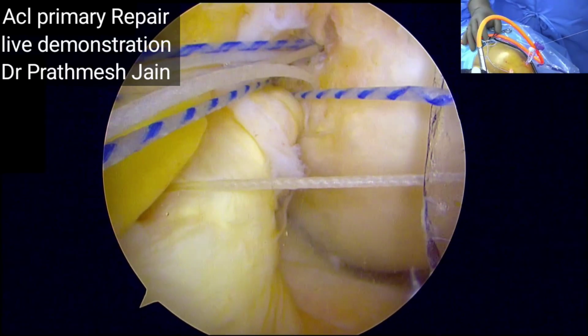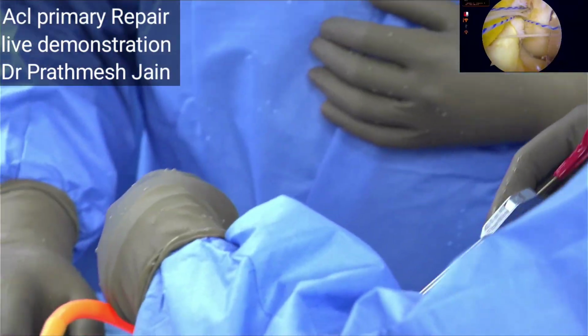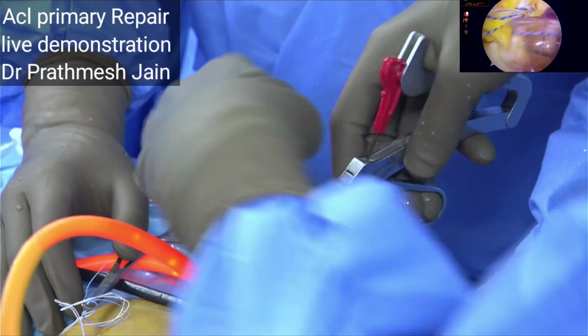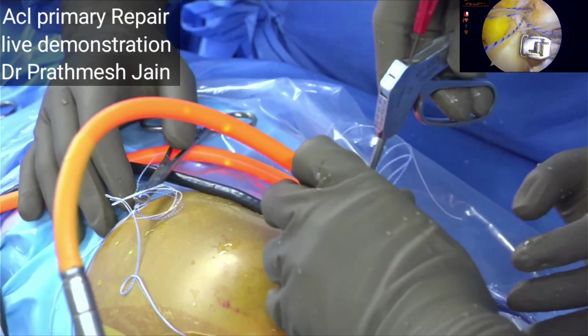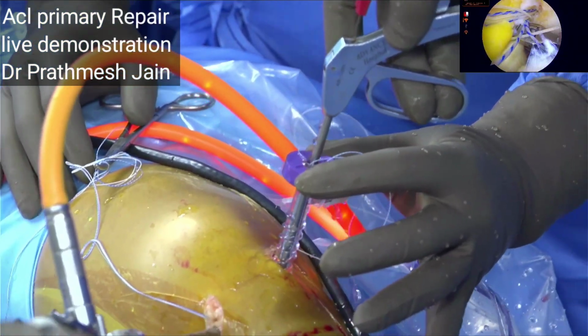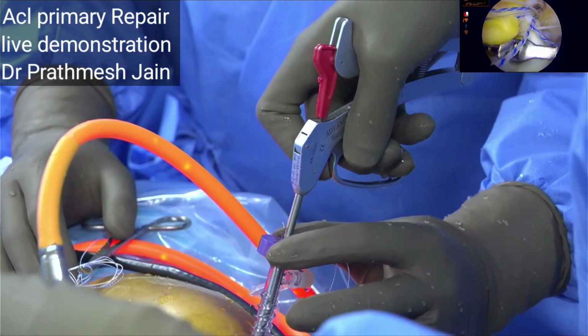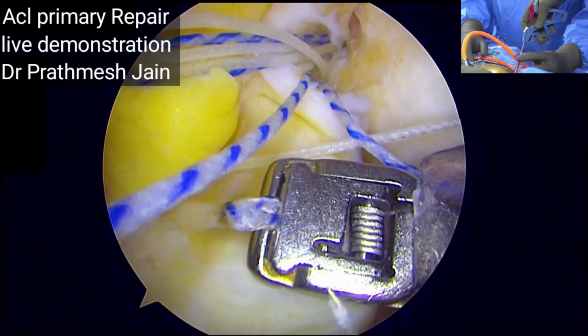Now this is the second suture. This is the blue suture. Here we will be taking only simple sutures. Please hold the cannula. Here we will be taking only the simple sutures into its place, and we will be taking the second bite like this very nicely.